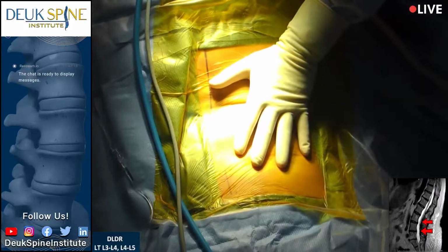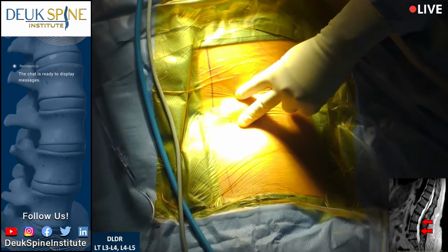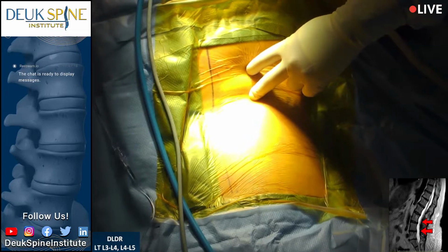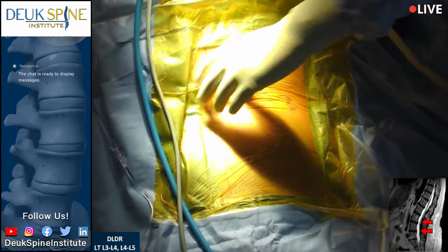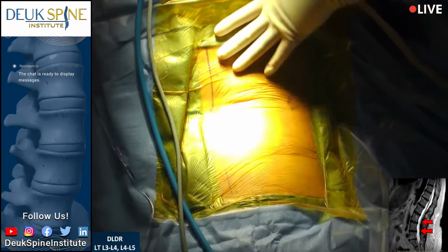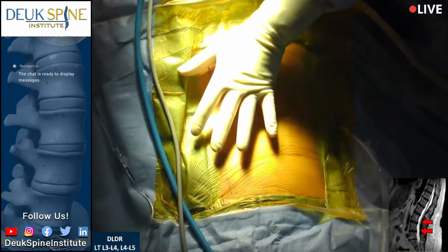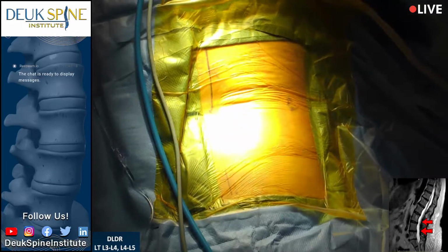Patient we're about to operate on has two herniated discs, L3-4, L4-5, and she has facet joint pain off to the left side at L4-5, L5-S1. So disc pain 3-4-4-5, facet joint pain L4-5, L5-S1. We figured all that out ahead of time during my examination of this patient in the clinic. You need to do a physical exam to know where pain comes from. And then we combine that information with their MRI.